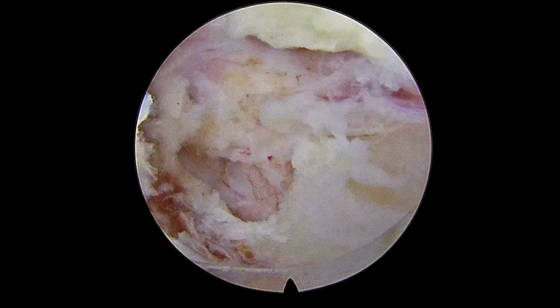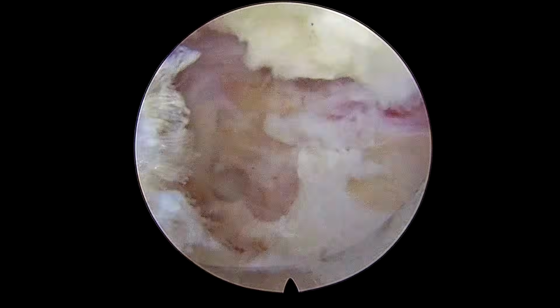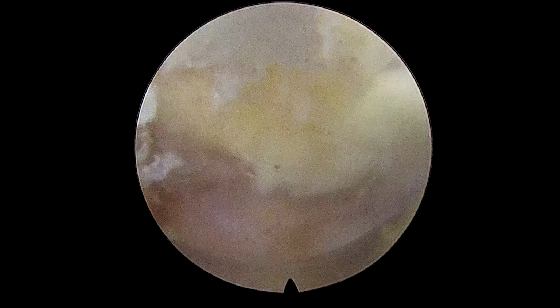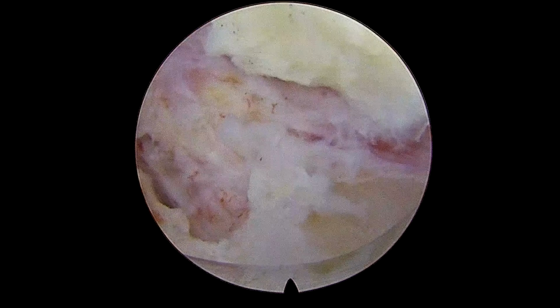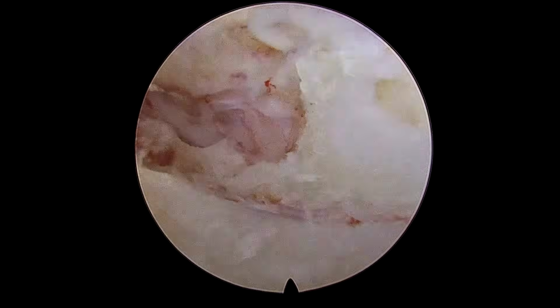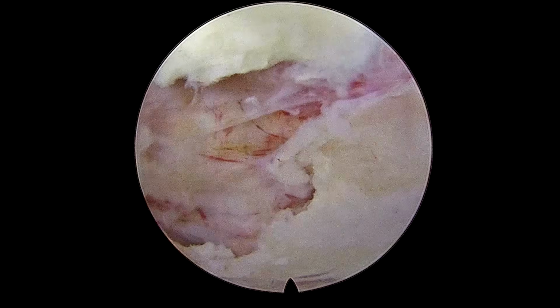So you have to be very careful. Sometimes the root gets pushed dorsally because of the underlying disc fragments. This time you may end up injuring the nerve root here. Till now we don't know what neurological structures are underneath. You have to be very careful here. We haven't exposed the nerve root here.